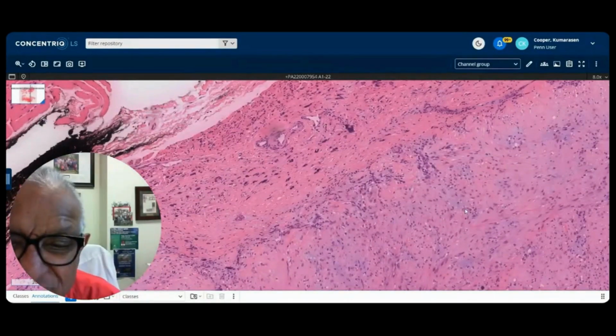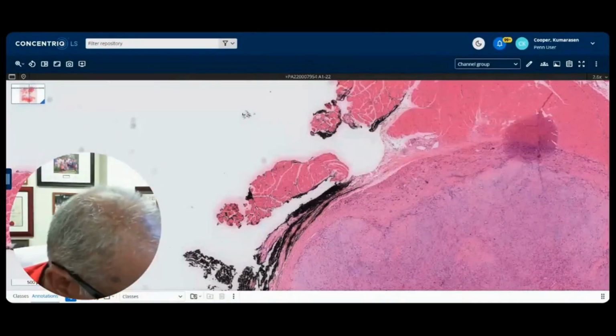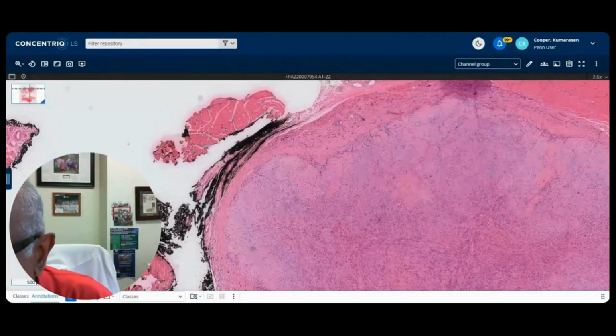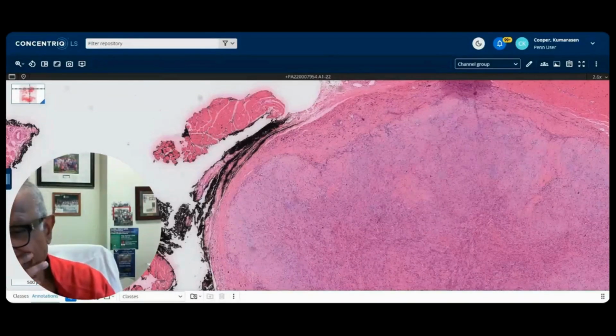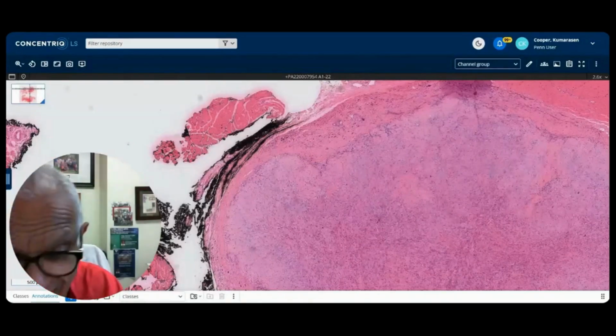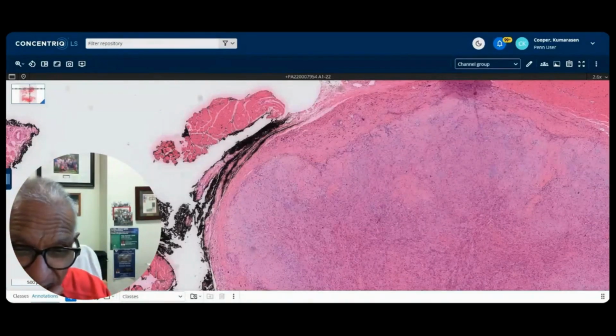Okay, so all right, something for you to chew on, something to think about. We have a minute or two. Myxoid AFH. Yeah, correct, myxoid AFH. Reparative. Well, that's always true, Mother. You could argue that as well. This seems to have some sort of a zoning process as well, with the peripheries being so uniformly sclerotic. It's always going to bring discussion, which is what I entertain, which is why I put this case in, for you to think about it and challenge me. I like that. I enjoy defending these things.